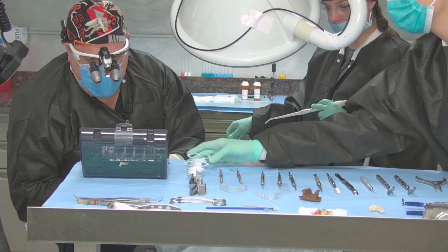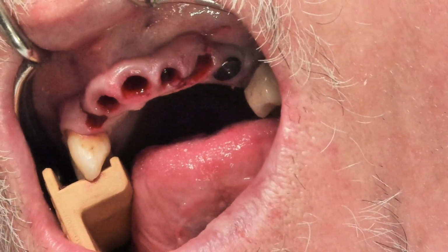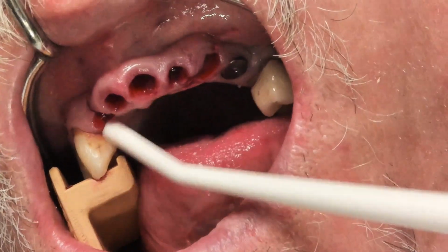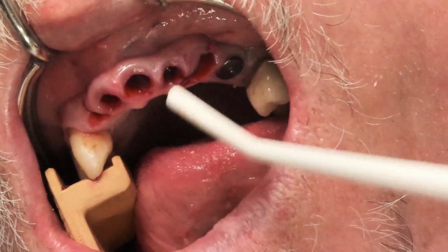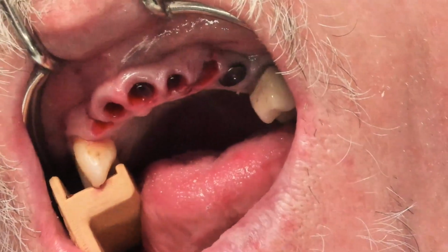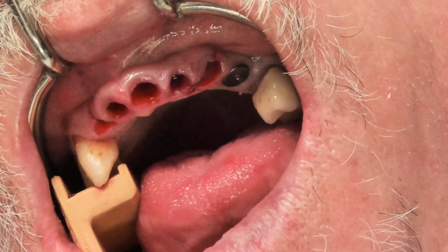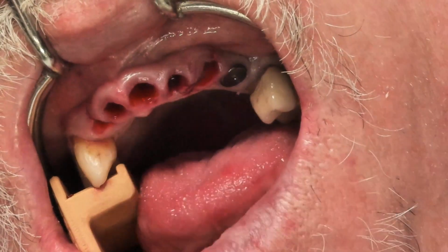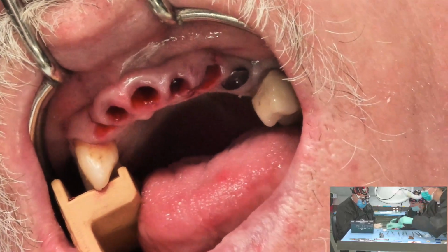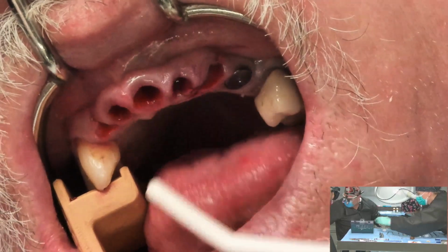What dimension implant are you placing? I'm putting in 4.0 one piece implants. Tapered. I'm going to show it to you in a second. I don't have the right size here yet. Take this out. Thank you. This is what happens when I take over instead of Nicole. You picked the wrong seating instrument, okay?